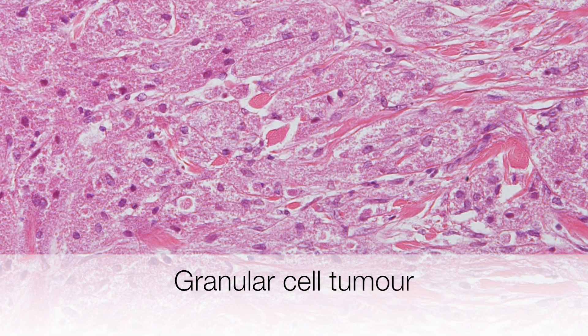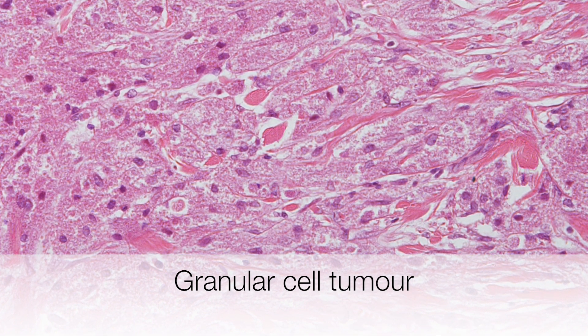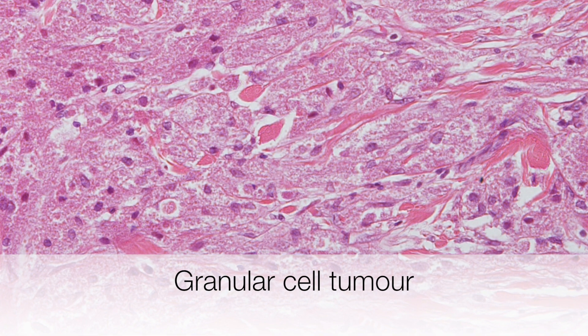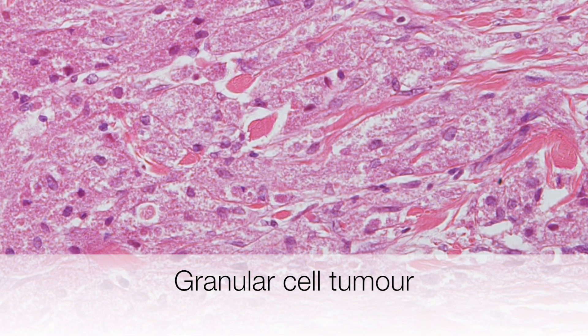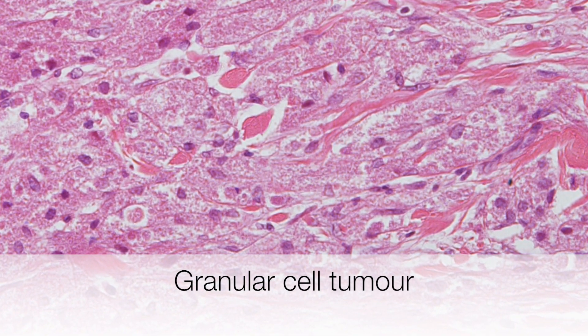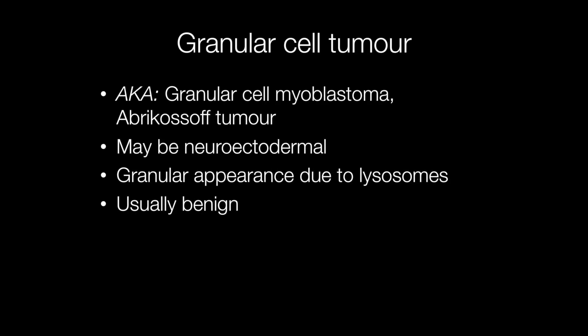This is a tumour composed of cells with abundant pink staining granular cytoplasm, and this is called a granular cell tumour. Granular cell tumours are thought to be predominantly neuroectodermal in origin. The granular appearance is due to the presence of lysosomes in the cytoplasm, and these lesions are usually benign.